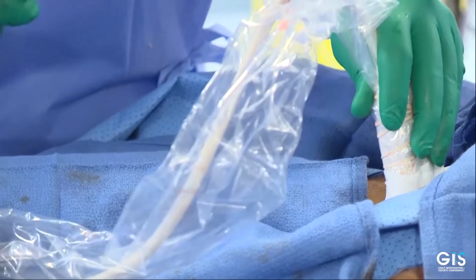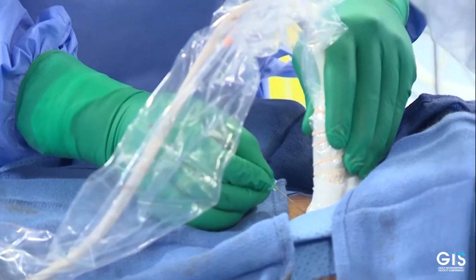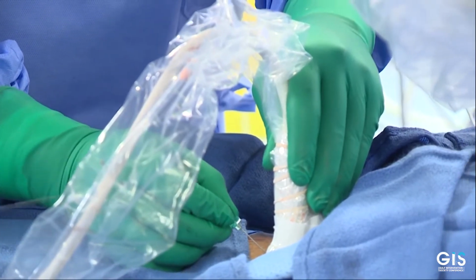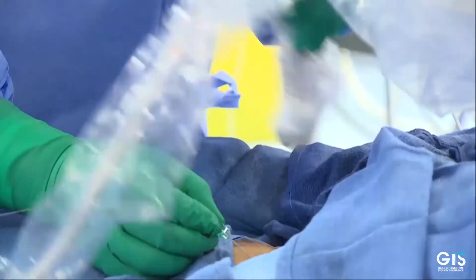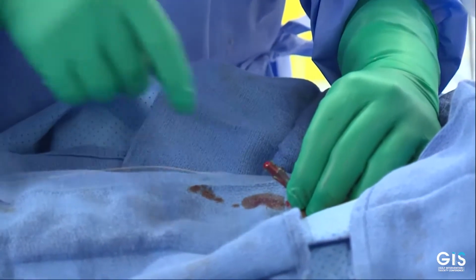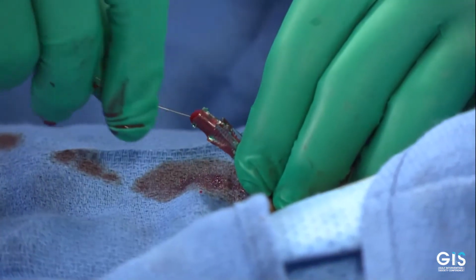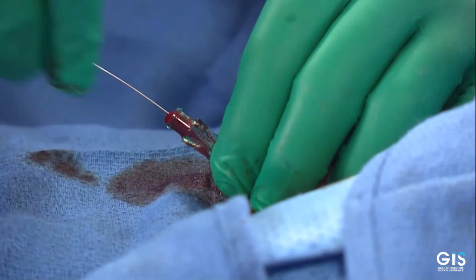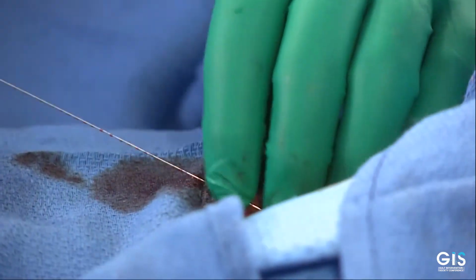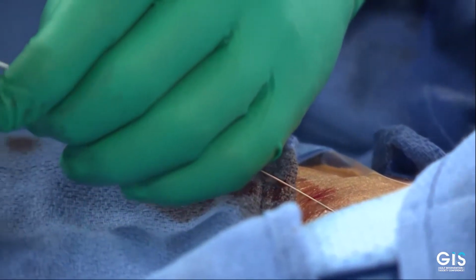So we determine the access point based on the ultrasound guidance. I'm currently on top of the artery, and I'm going to just puncture. And as you can see, if you focus here, you could see the pulsatile flow of the blood, suggesting that you're in the true lumen. And after establishing the access, we will insert this 4 French micropuncture sheath.